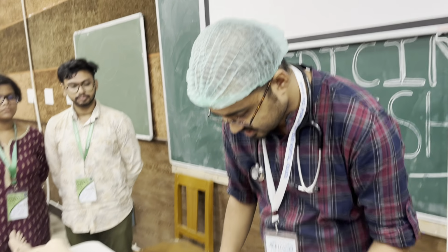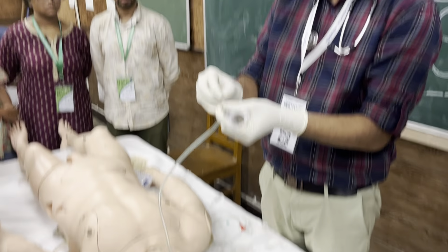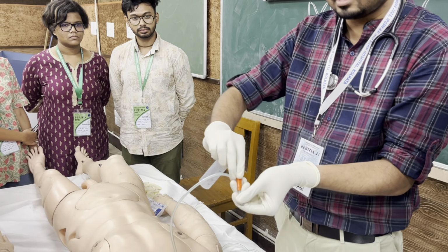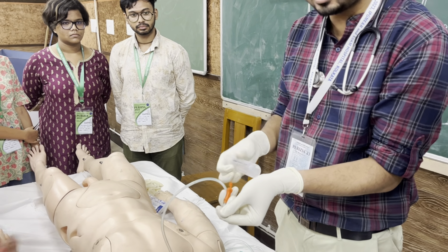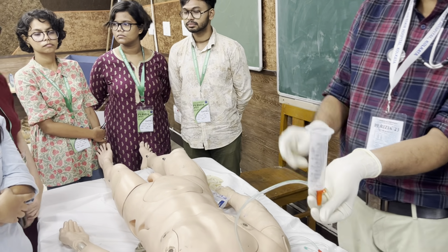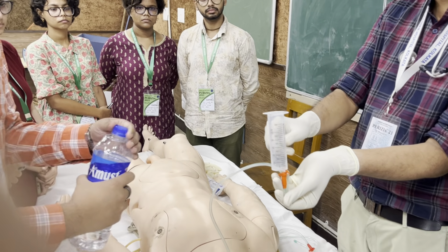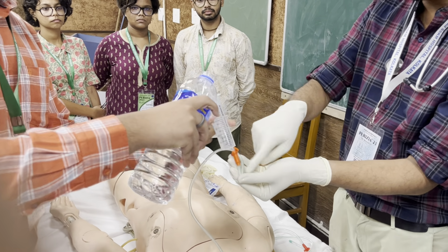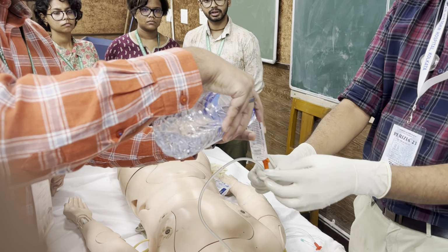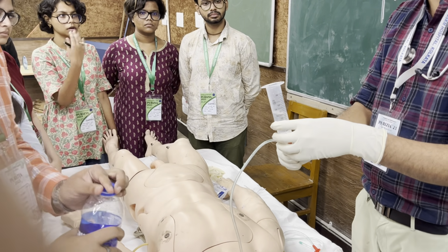And how to feed? You can attach one tube here. First close this part, attach one tube without plunger. Attach one tube. I need some water actually. So as I have put this, I have attached this with this tube. You can put some water and close this tube by bending. Okay, close this tube. Why is closing important? Bending is important because air can go inside.